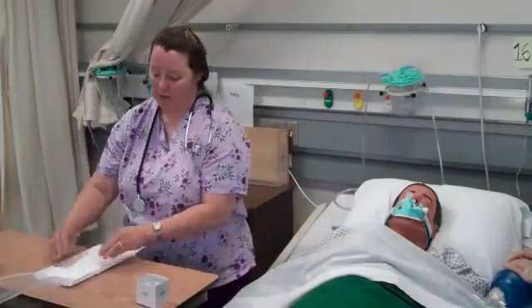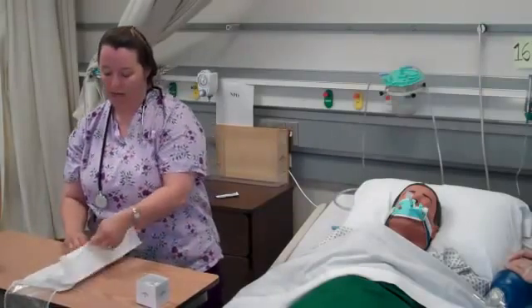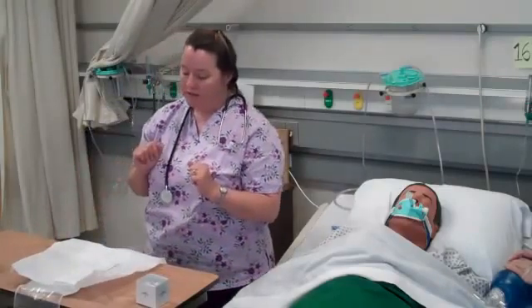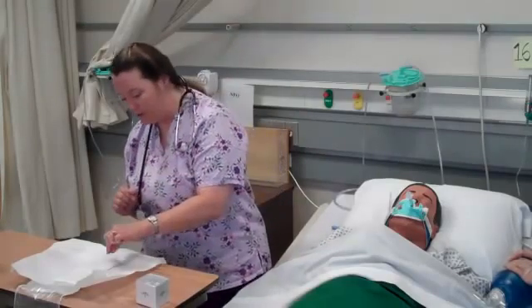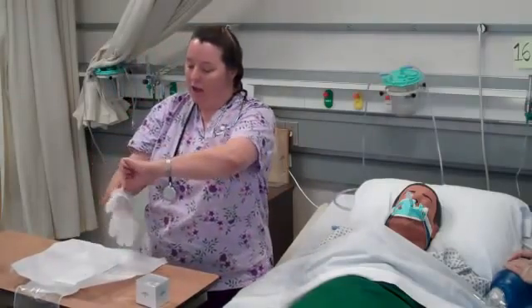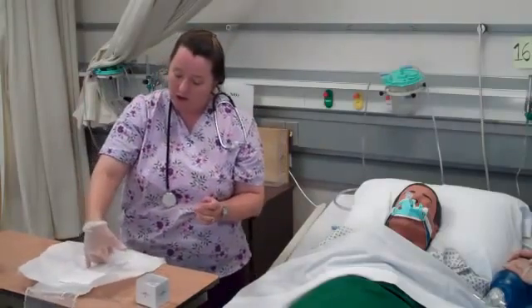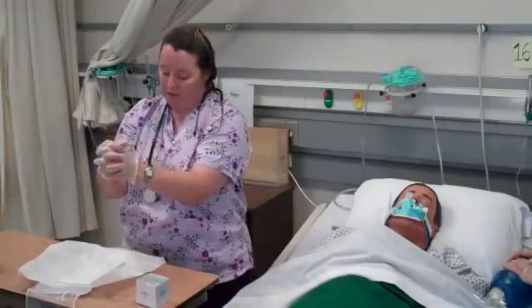Now I can open up my catheter kit. I'm uncrimping those edges so it doesn't pop back on me, and I'm only touching the outer inch to maintain sterility of the equipment inside. The gloves inside are sterile and are not labeled right or left. I'm going to glove my dominant hand first, touching only the cuff part that contacts my skin. Now sterile — I'll do a fit test.